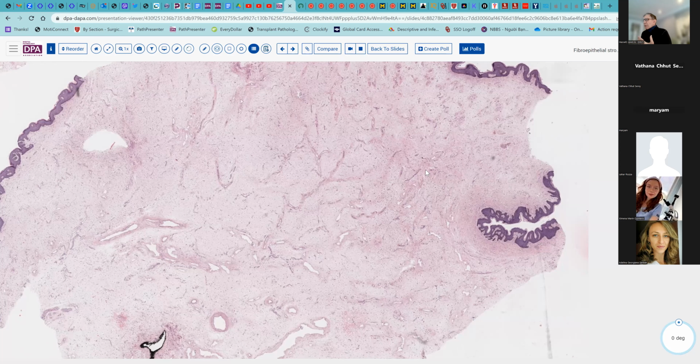But in terms of chemotherapy, radiation therapy, and so forth, they're going to treat it as an endometrioid tumor. And again, the staining pattern will be different with the P16. The staining pattern with PAX8 and so forth will be different. Even cervical endometrioid tumors will have PAX8 positivity.